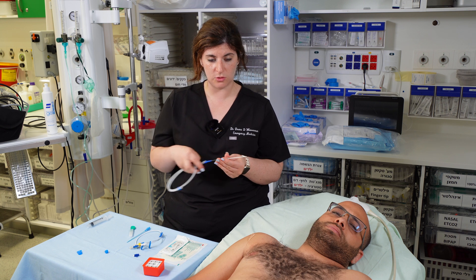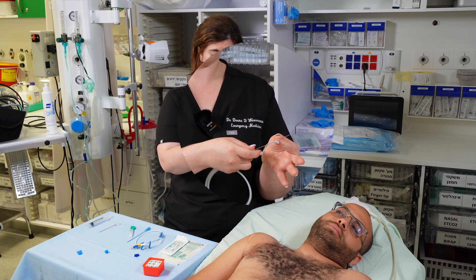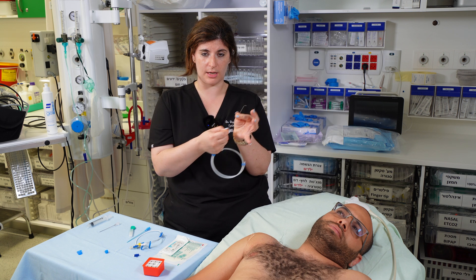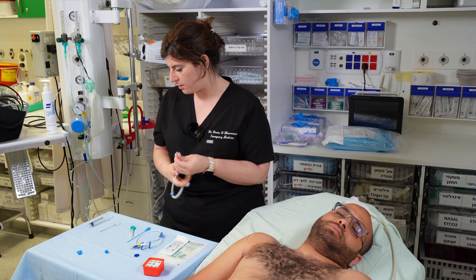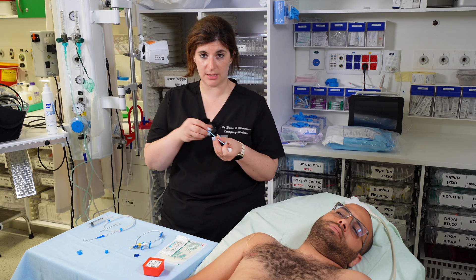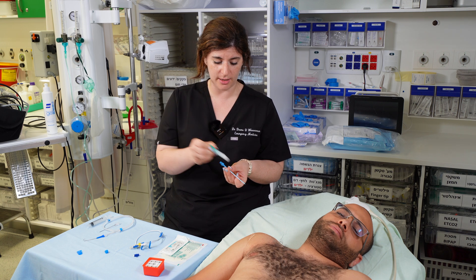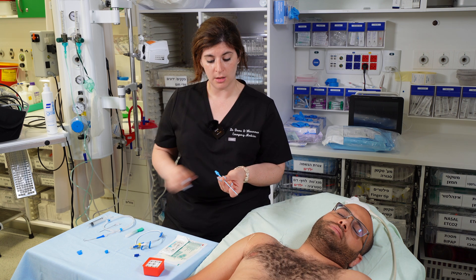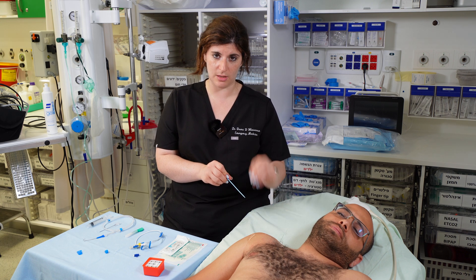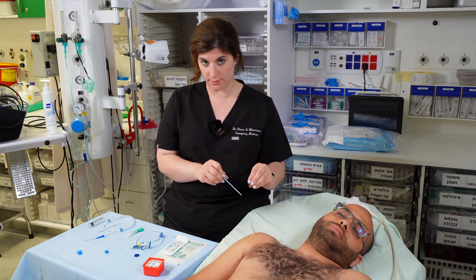Another option is to straighten out the hook: hold the wire proximally and pull distally to straighten the end. Once the wire is safely in, thread your dilator over the wire. When the dilator is flush with the skin, take your knife and make a nick in the skin. Use a piece of gauze to hold the nick site so it doesn't create a mess when it bleeds, keeping your area clean and clear.